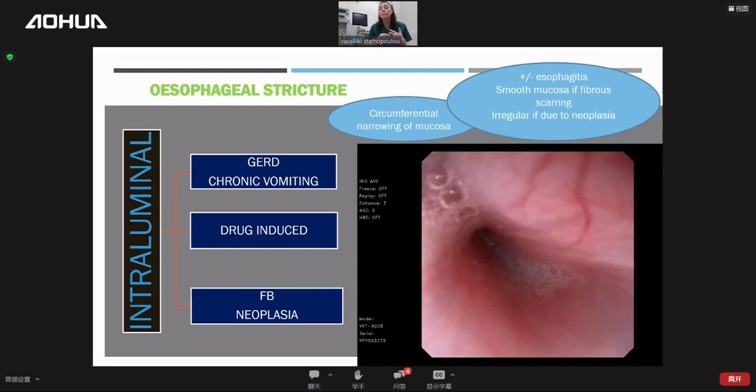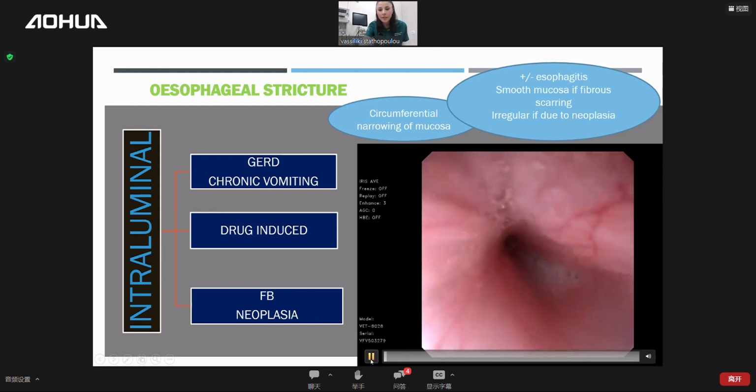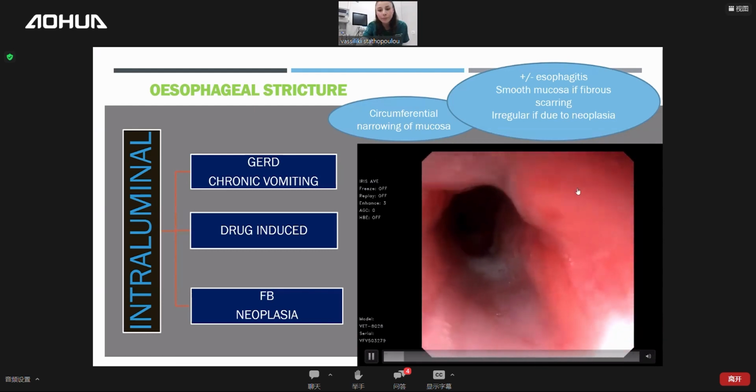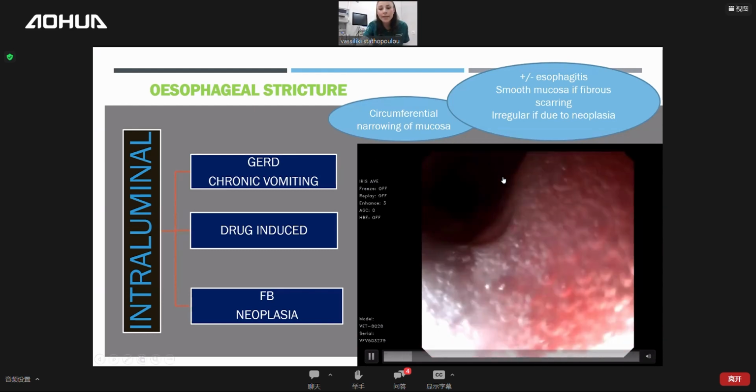And the second most popular way of having an esophageal stricture in cat is pills. We have written an article published that even amoxicillin and clavulanic acid can cause, if not given properly, esophageal stricture through a mechanical way of the pill. And this, the capsules are even worse for cats. Okay, let's see this stricture in a cat. It is a cat because you can see the vessels. Okay. So we see esophagitis here.